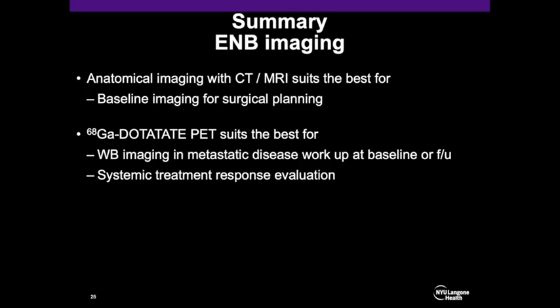However, when we talk about the whole body imaging in the metastatic disease workup, either at baseline or follow-up, as well as the systemic and local treatment response evaluation, gallium dotatate PET has a critical value and holds a future promise in the esthesioneuroblastoma imaging and treatment response follow-up.